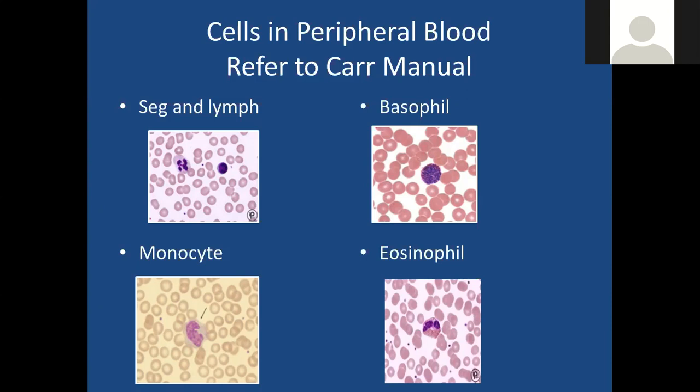So you said it's often a basophil with so many granules you can't see anything else. Right. Those granules will be so prominent, that's pretty much the only thing you'll see in the cell. You won't be able to tell there's a nucleus under there, but there is. And your eosinophil has a nucleus too. It is oftentimes bilobed, but I have seen an eosinophil have 3 lobes. So it's not abnormal, just most oftentimes that eosinophil is going to have 2 lobes.